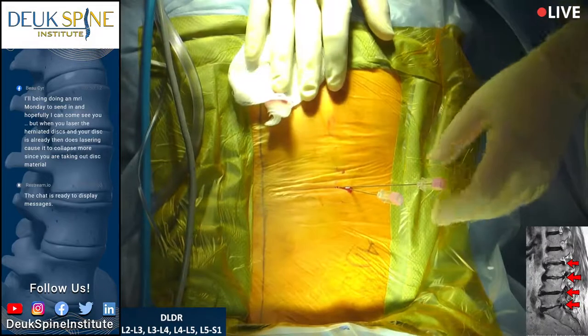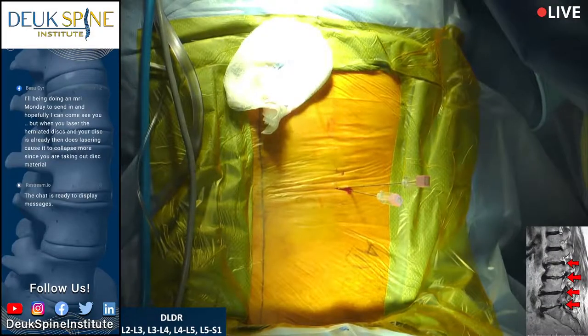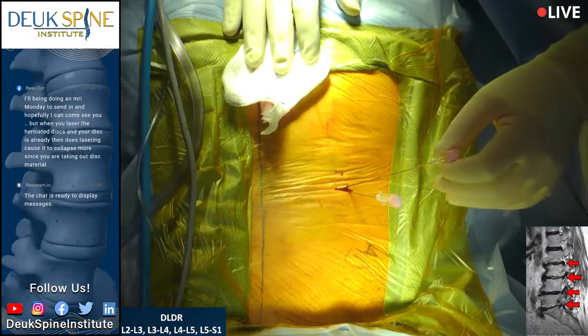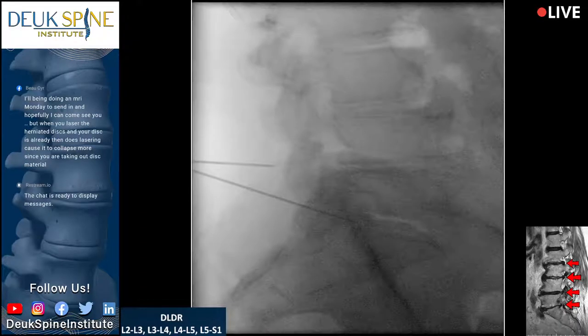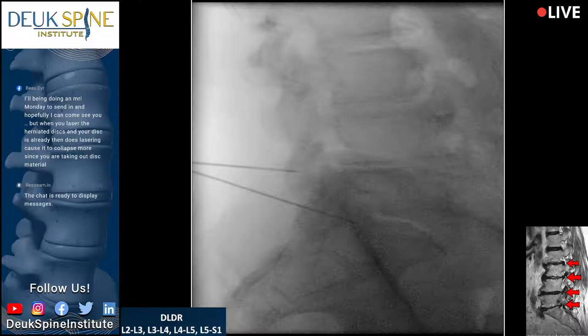We're going to go for L4-5. And what makes this case so difficult is not our equipment. Our equipment is the same equipment we use for everybody. And it's not my technique. My technique is the same. It's really the spine. Each patient's spine is different. And this patient's spine is a very difficult spine to do because of the amount of severe arthritis he has. It is just severe. And that doesn't stop me from trying to help people.